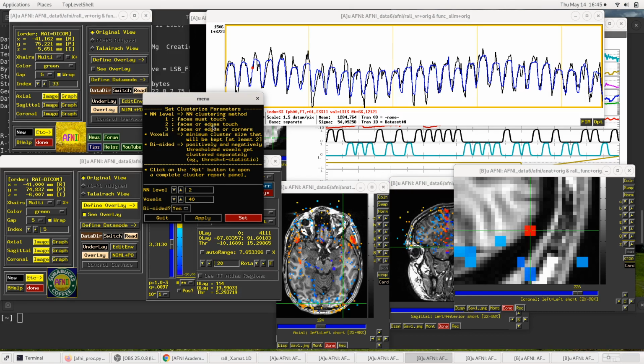And then if you allow the edges to touch, picture a 3 by 3 by 3 collection of shoeboxes. There's a central shoebox, a central voxel, and then there are 6 first neighbors around it. If the faces or edges can touch, there will be 18 second neighbors.